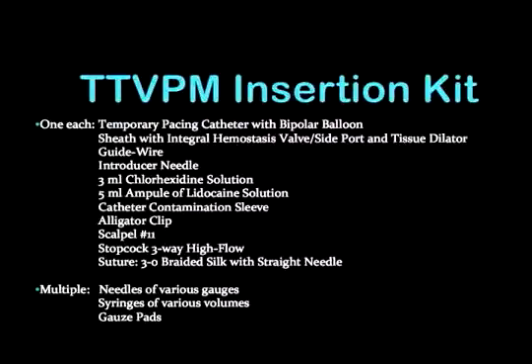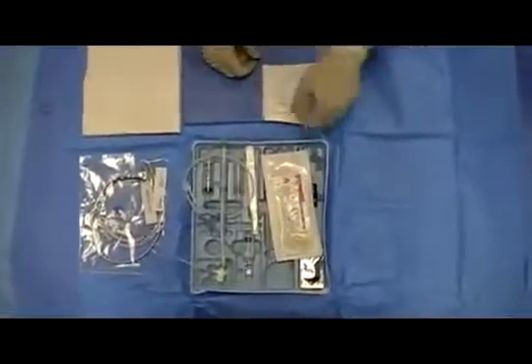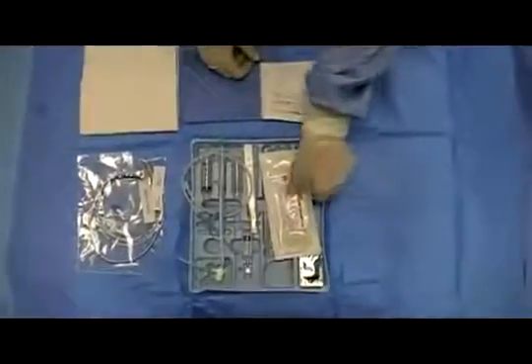Multiple manufacturers produce a variety of kits to perform this procedure. Our kit includes the following list, which we will show at this time. Here are the contents of the transvenous pacer kit, some of which would also be found in a central venous catheter kit.